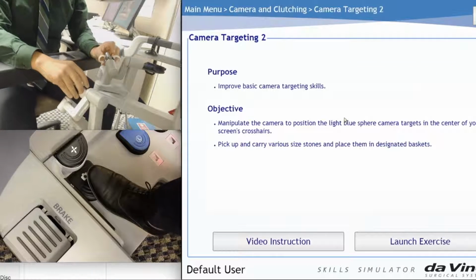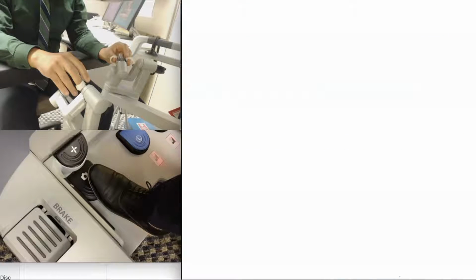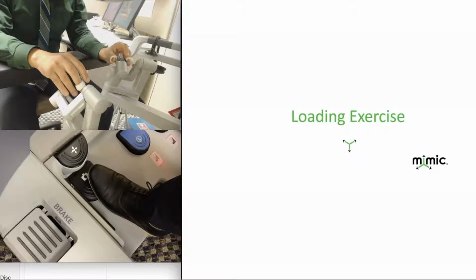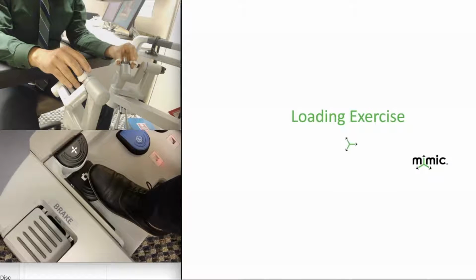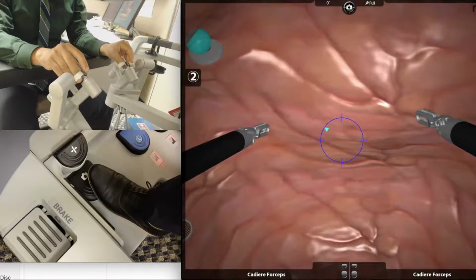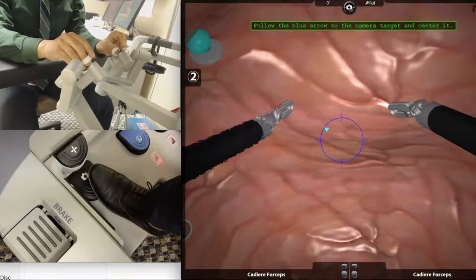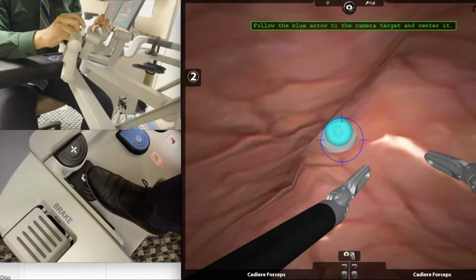In a few seconds, when the task loads, I will demonstrate the finger clutch. This will be accompanied by a distinct sound, as well as two fingers flashing at the 6 o'clock position in the main screen. To free up this first target, I will activate the clutch twice.